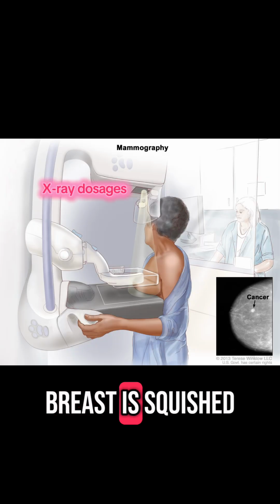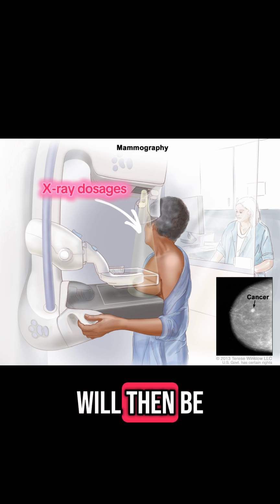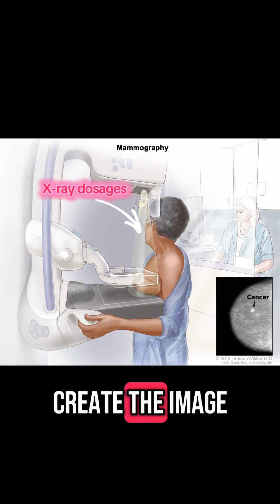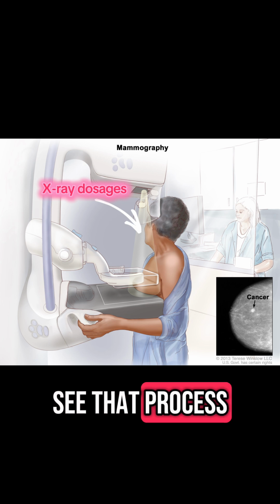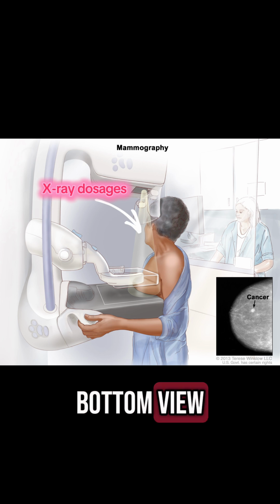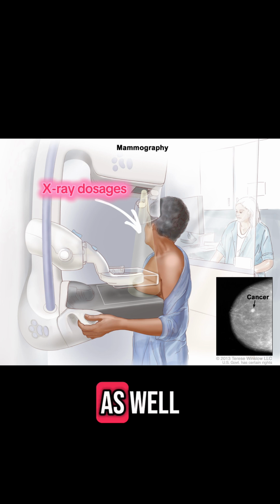So once the breast is squished with those 2 plates, a low dosage of x-rays will then be sent down onto the breast that will actually create the image of the breast tissue. So in this picture, we can kind of see that process of squishing the breast downward so you get the top and bottom view, but also what the dosage of x-ray would look like going onto the breast as well.